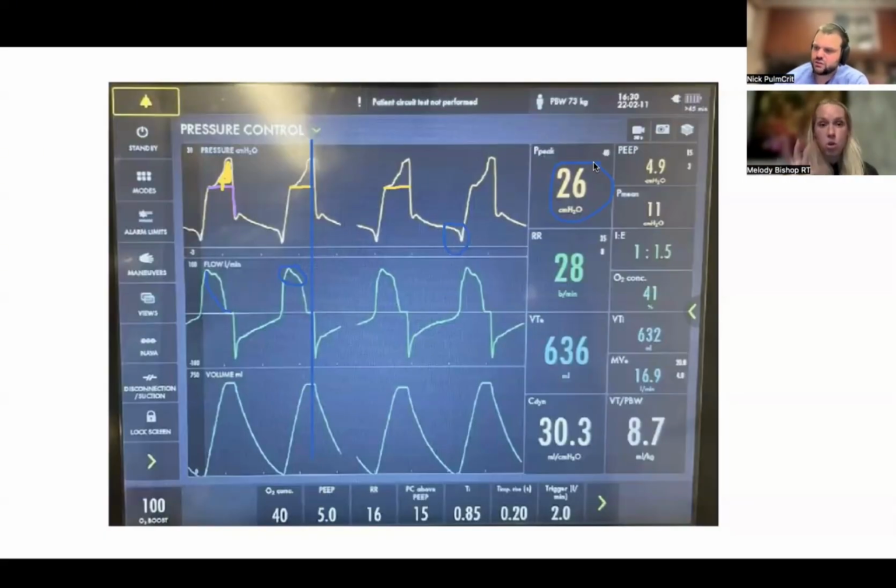They're too acute, obviously, because of how they're breathing, to probably stay in pressure support, because inevitably they're going to end up with more sedation on board, let's be honest. Or another clinician at the bedside might end up trying to play with the inspiratory time. I kind of got lost. But if I leave them in pressure support, I feel like they might end up in something worse off, like PRVC. Good point.